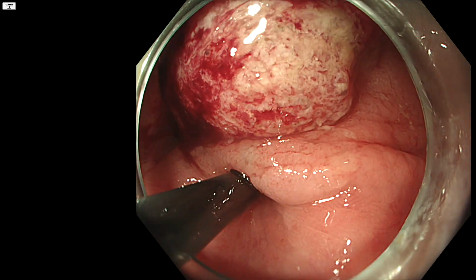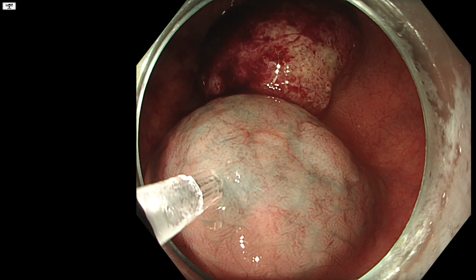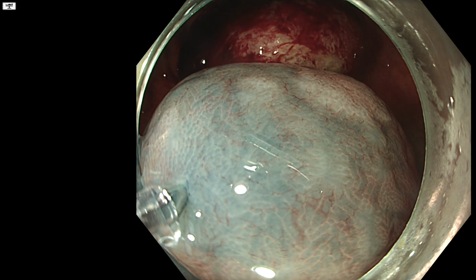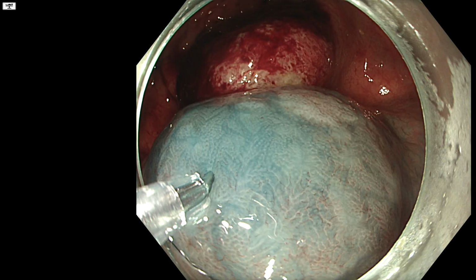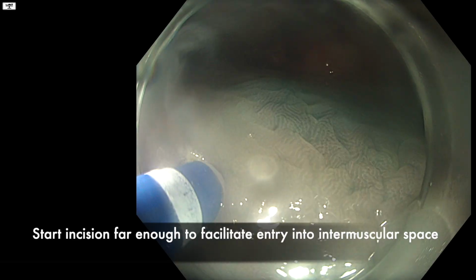Okay, so we're injecting now. As you can see, we're starting well away from the lesion itself. We're doing this deliberately in order to build a wide and stable pocket in the healthy tissue before we actually approach the intermuscular plane. The idea being that a stable pocket will give us the necessary counter traction and working space so that we can enter the intermuscular plane safely and with more control.